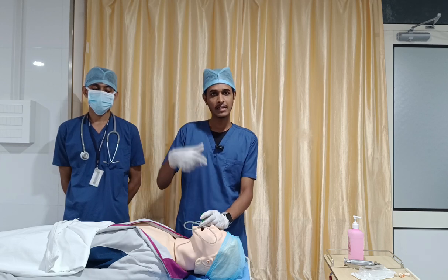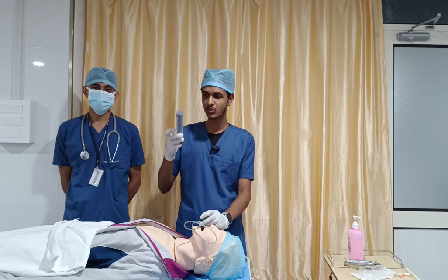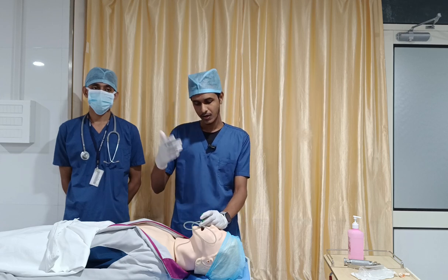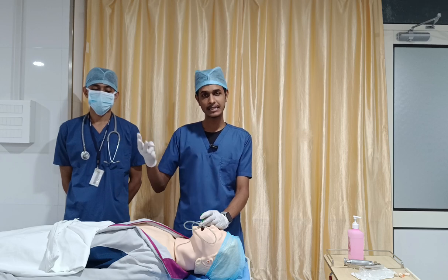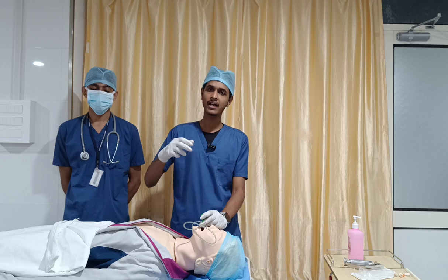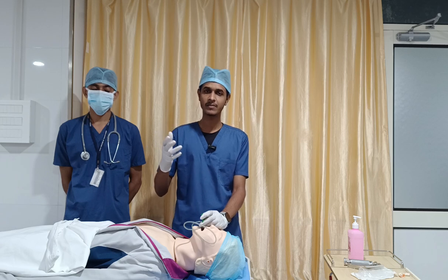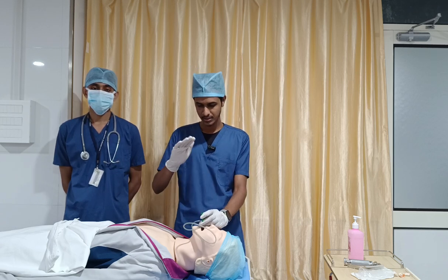First one, you can give a thrust. It should not be a slow laminar flow, you have to give a thrust. You can hear a click sound over the epigastric region. Second, you can aspirate the gastric content and check it on pH paper. Third, you can inject 20 to 30 ml of water and then you have to retain it back immediately. If you are getting more than 70% of the water back, then you can verify that it is in the gastric area. So this is the way.